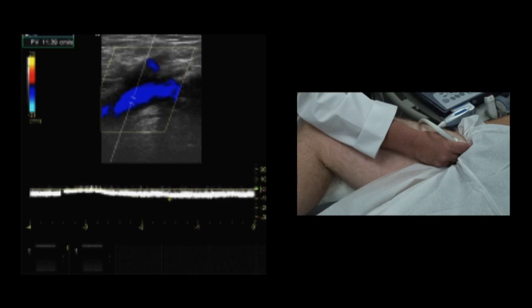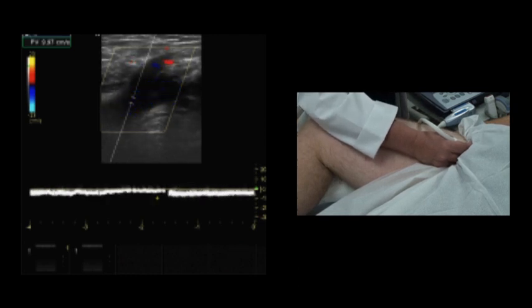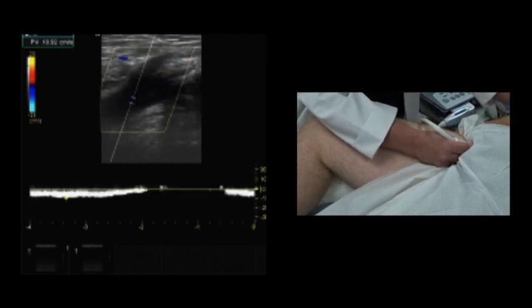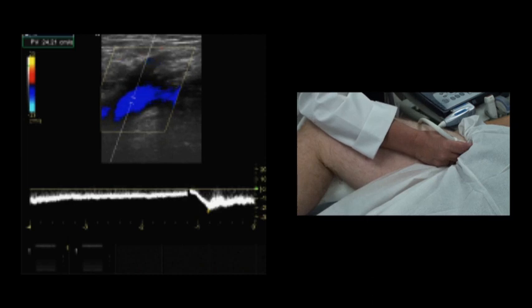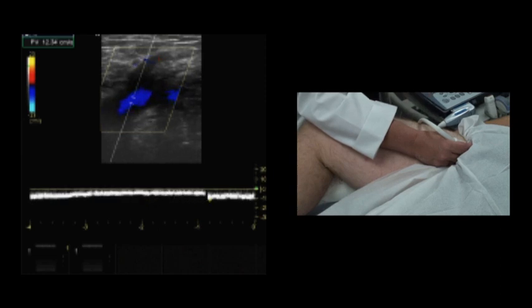It was retrograde. Also, another way to be able to demonstrate this is by doing a proximal compression. And you want to make sure that you do a very good proximal compression. And I prefer to do it on the abdomen and then press. Release. And if you notice, once again, he had reversal of flow. So now we have a Valsalva that's allowing us to know that there is reversal of flow, suggesting that there is reflux. We also did a proximal compression, which is forcing the blood backwards, trying to evaluate those valves.